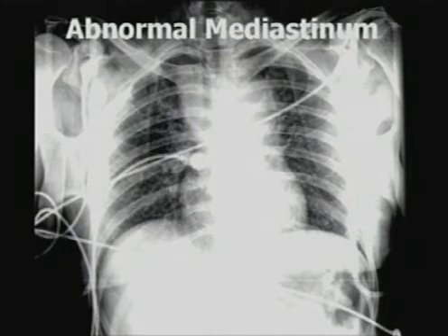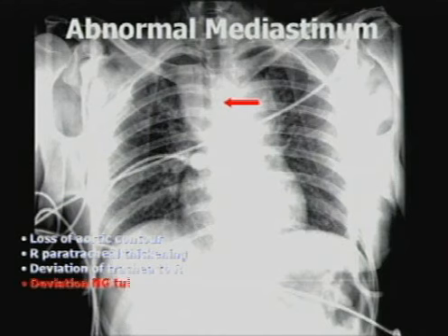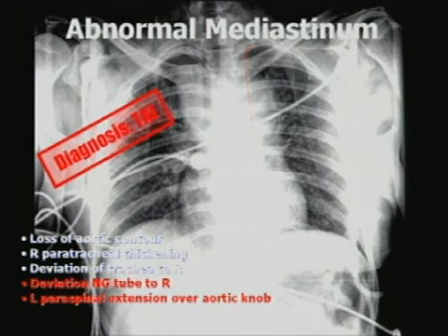Now, this is clearly the abnormal mediastinum. So the features we see here are we have lost our aortic contour, which would be somewhere along that dotted line. We see marked thickening in our right paratracheal region, and we've got significant deviation of the trachea over toward the right side on this relatively unrotated view. If there was a nasogastric tube, it would likely be pushed over toward the right as well. And another thing you might see is that left paraspinal line, if it extends up above the expected location of your aortic knob, that's a sign that there's probably mediastinal blood. That can actually form what we all know as the apical cap. This was an aortic injury.